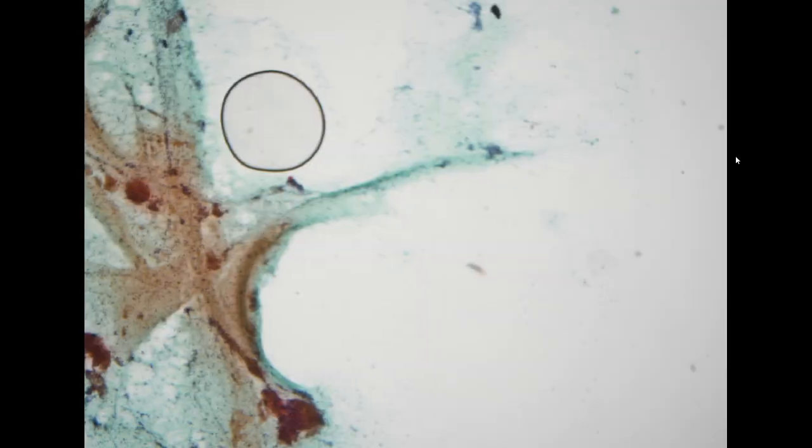Because of this high cellularity, we decided to do a cell block preparation just for further ancillary testing. So let's take a look at the direct smear first.